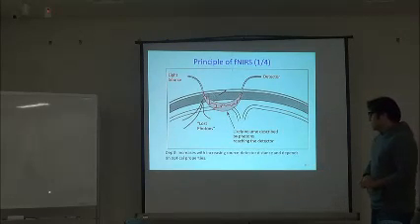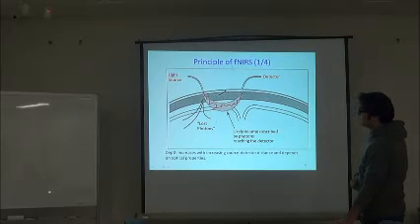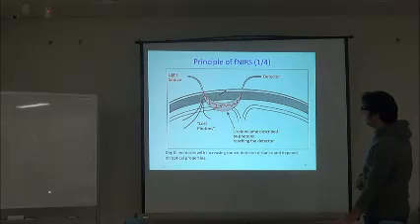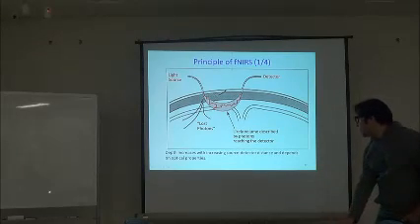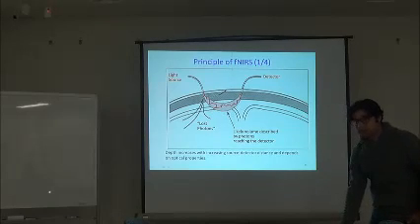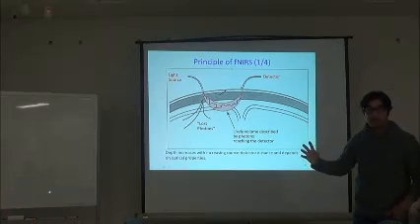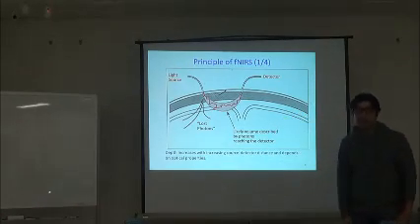So the depth increases with the source to detector distance, and it depends on the optical properties of the tissue. In this case, we have the brain tissue. And this is the most likely volume that is described by the photons that reach the detector, about 80% of the detected photons.